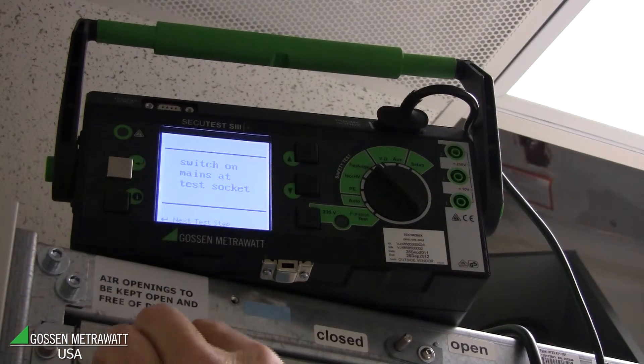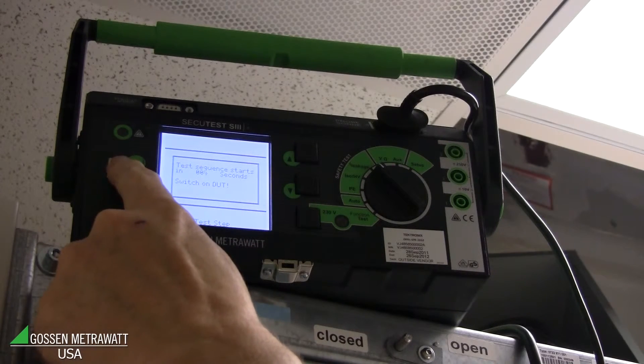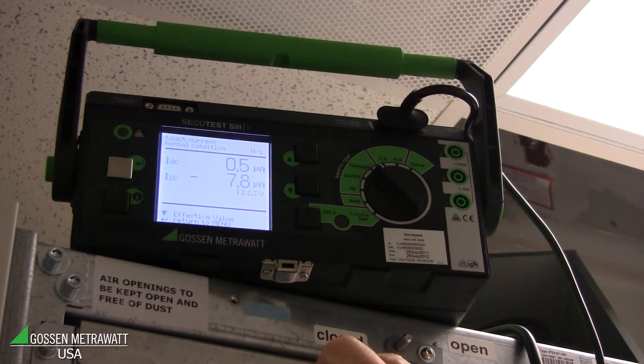The equipment is already switched on, and in this next step you will see the leakage current is very low — only 10 to 15 microamps. We can switch to AC and DC view and see that most of the leakage current is DC, but it's very low and well below the allowable values.